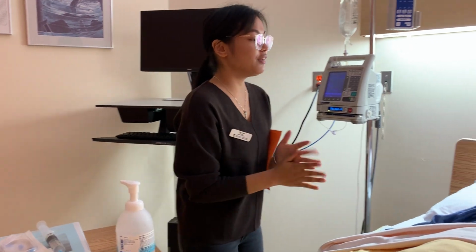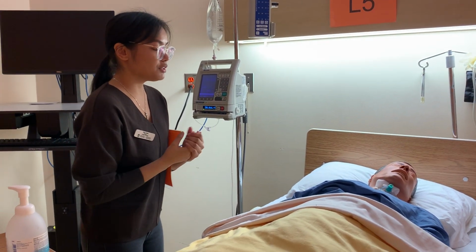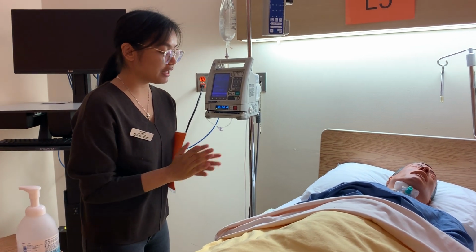I'm going to introduce myself. Hello, Miss Erica. My name is Kim Lontoc. I'm your student nurse today. I'm going to give you your medication, but first of all, can I look at your arm site?